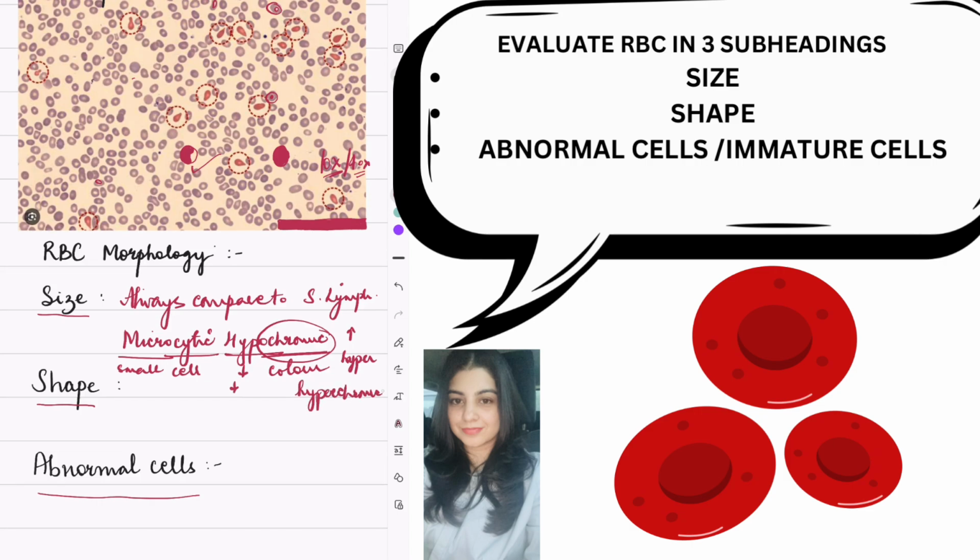But mostly hyperchromic is used for malignant cells while we are describing the nucleus. So we are mostly tackling hypochromia in hematology peripheral smears. Now, through size we have decided that this is microcytic hypochromic, in comparison with the small lymphocyte, and also the color of the pallor inside the RBC.